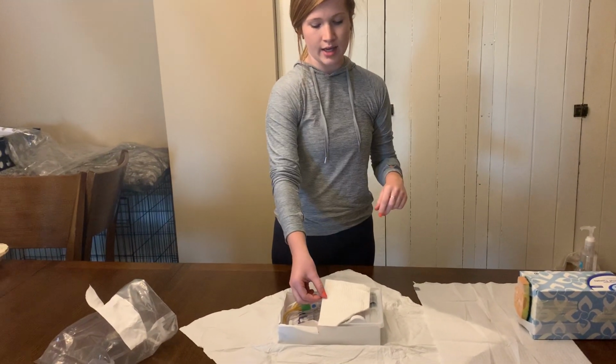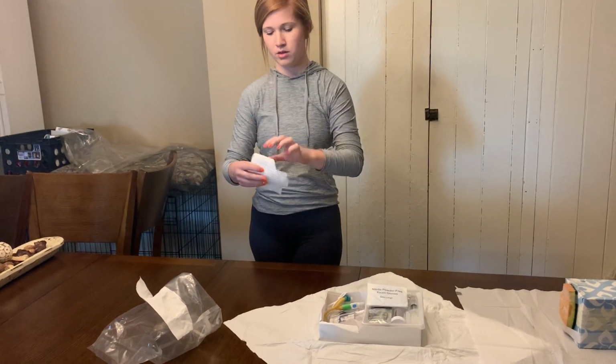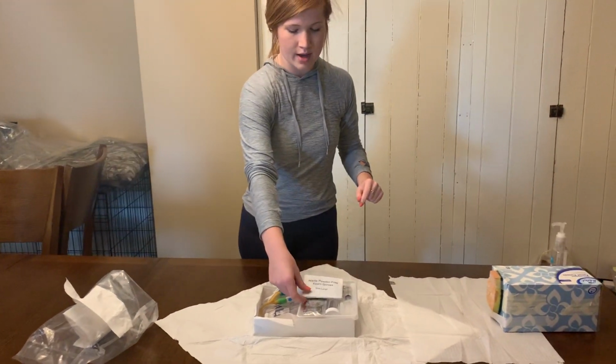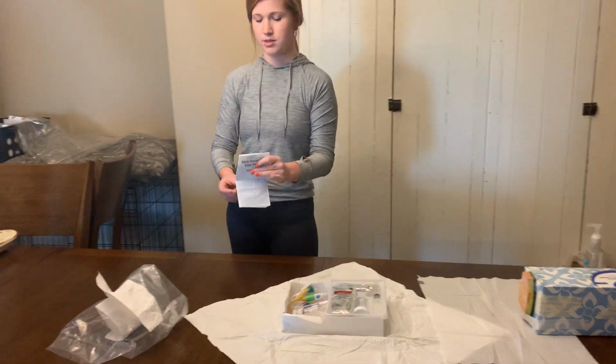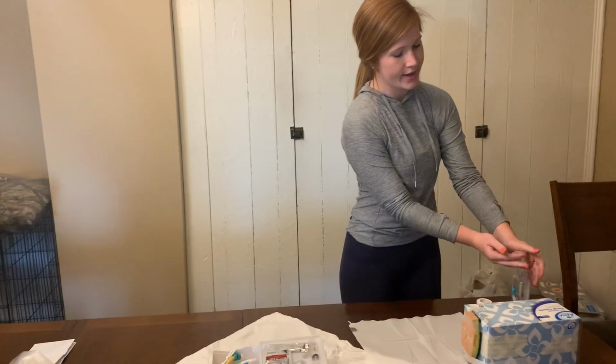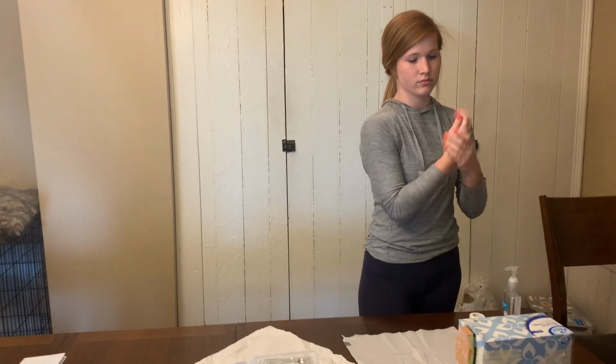And then I can dispose of this other drape because I will not be using it. And then I will get my sterile gloves out of the box. Before I put those on, I'm going to perform hand hygiene. And I'm actually going to backtrack here for a second. I just realized I forgot to position my patient.